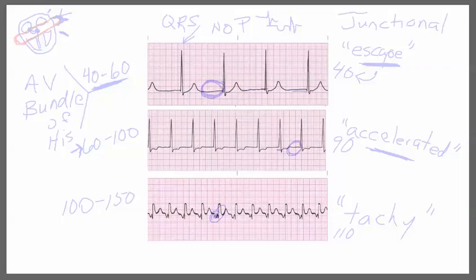On the third strip, the QRS is still within normal limits, although it may look a little wide. The P wave is inverted. In junctional rhythms, it will either present with no P wave — flat — or you'll see that inverted P. The inverted P wave here indicates that the problem is occurring at the junction. The QRS is responding adequately and is narrow. We're going to call this junctional tachycardia because the heart rate is 110.